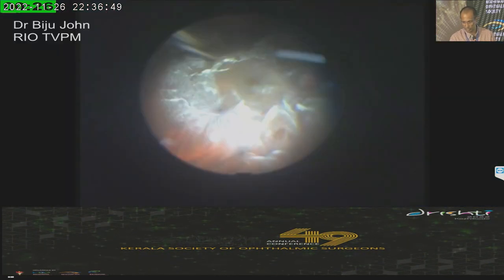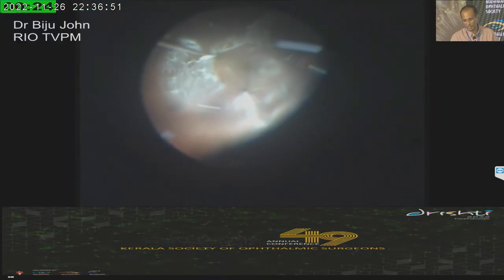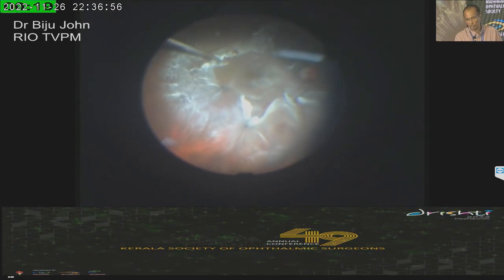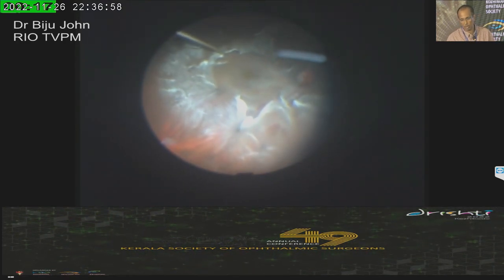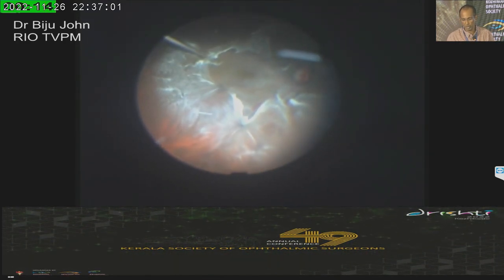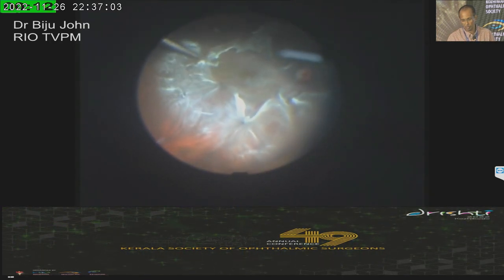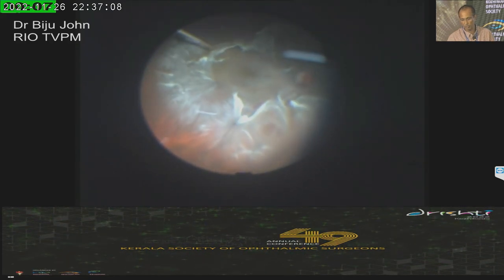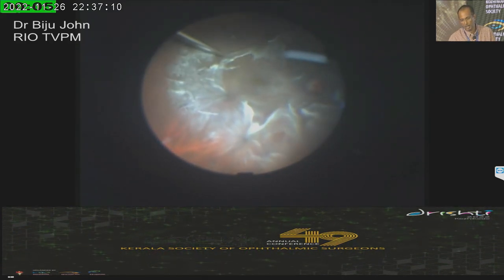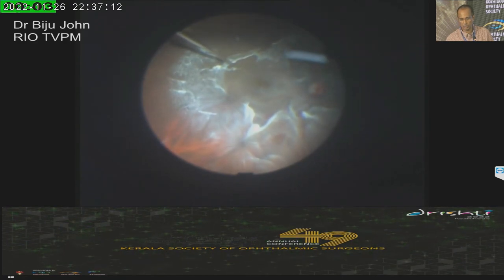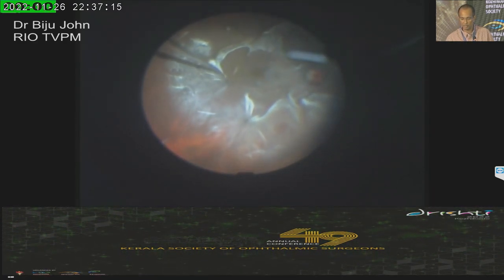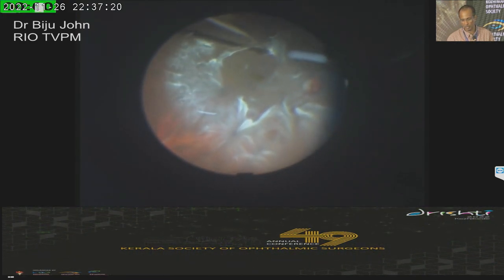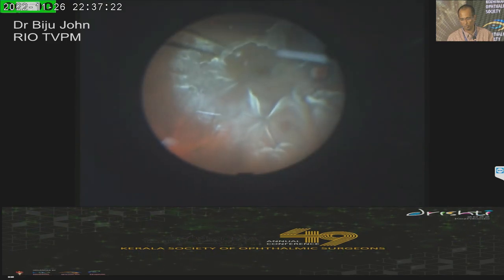In some cases — especially secondary ERM — the PVD was very thick and there was a posterior hyaloid. There was triamcinolone crystal still remaining, so I had to incise the posterior hyaloid with a membrane pick, then peel the hyaloid as another membrane. In this area, you can see that the hyaloid is actually attached to the ERM, and along with the hyaloid, the ERM also comes off.